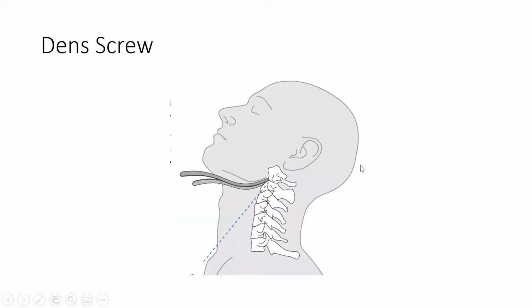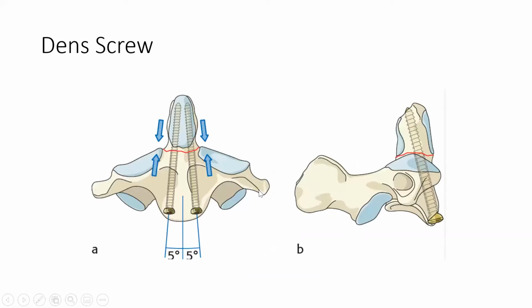This is a typical scenario, seeing a retractor you put under the neck. You make an incision around the C5-6 level, and you just go under the esophagus, put your retractor up here, and that's your line of sight. In patients with a short neck and a big barrel chest, you often cannot get the angle to get the peg screw in there. It's technically quite challenging. It is described to use 2 screws, but one screw is mechanically good enough. That's the angle of your screw.